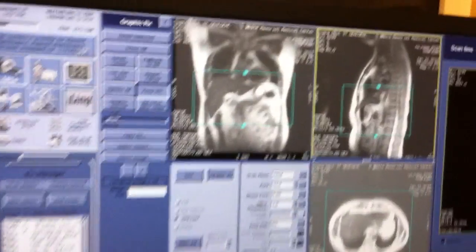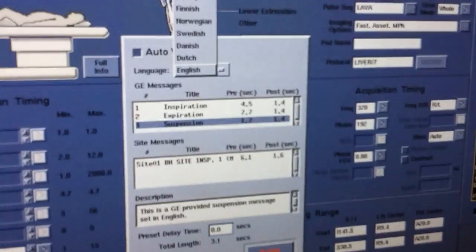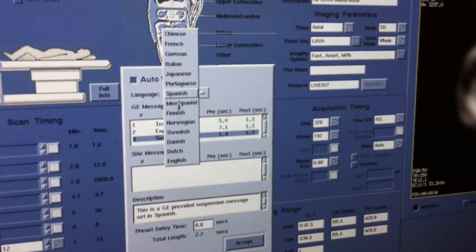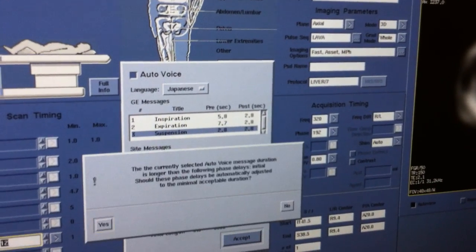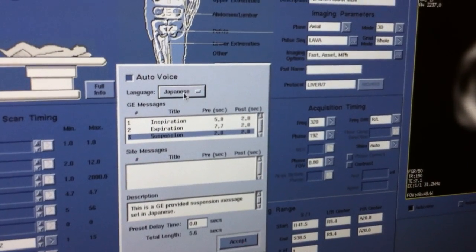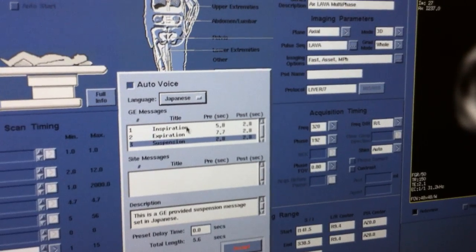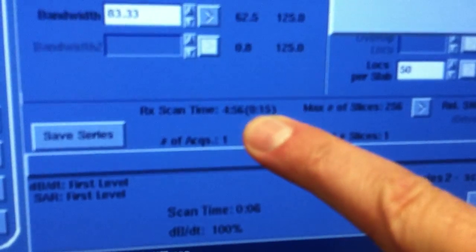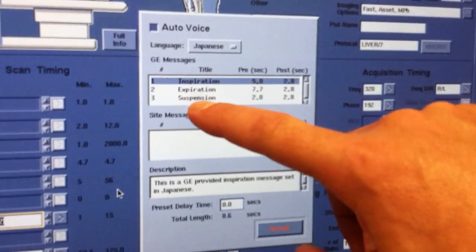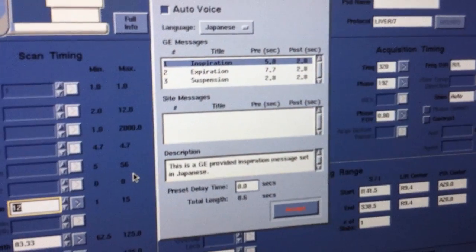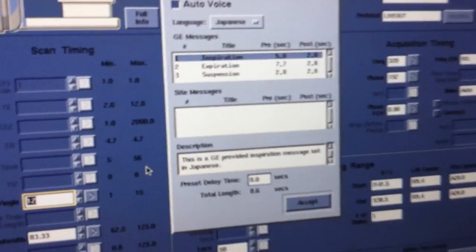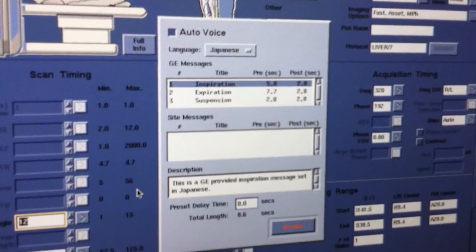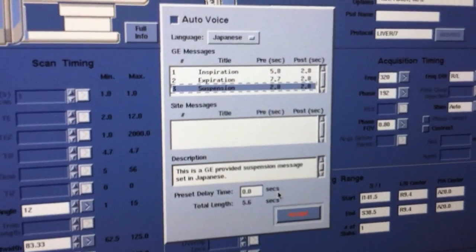If you need to change your auto voice, if you want to put it in Spanish, you want to put it in Japanese, whatever it is, this is it. These scans, these lava scans, multiple scans are only 15 seconds long. So, you don't need an inspiration. You can go just suspension. Suspension will tell the patient, hold your breath. It's not going to tell them to breathe in and hold, just hold their breath. So, this is the best one to use in this case.